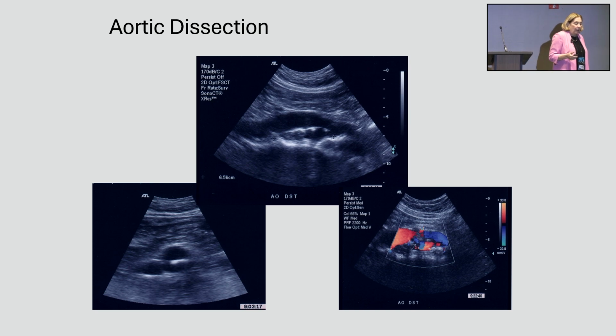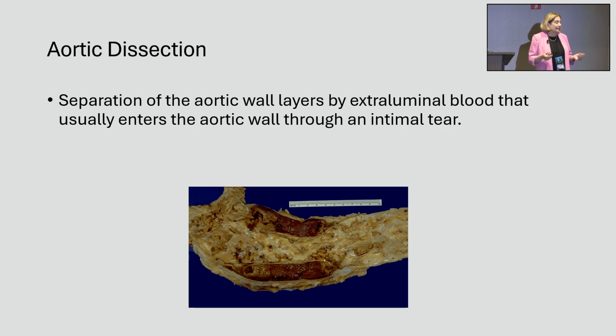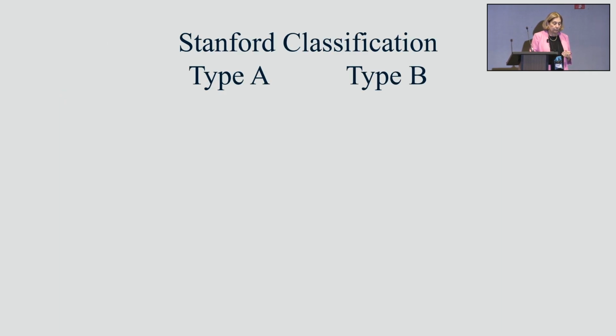But we can also find aortic dissections. Dissection is a pulling away of part of the wall and having a separate flow channel. Transverse, long, color, take color off too, and look. When we see this separation through the walls, then we can say that is a dissection, or appears to be a dissection.